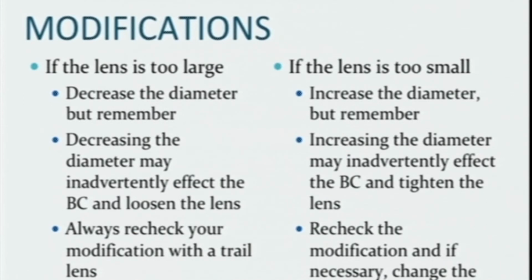How do you modify? If it is too large, decrease the diameter, but remember the decreasing diameter may inadvertently affect the base curve. And recheck your modification with the trial lens. You should have a trial fit ready.